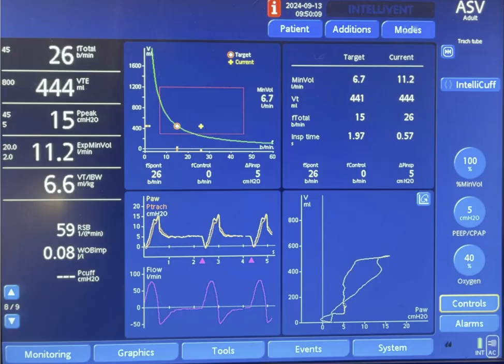Of course once the patient initiating the breath the pressure goes down and you can see it goes down to minus 1 correlating to this point here. And then the pressure goes up to around 15. This spike here is correlating with this one here.